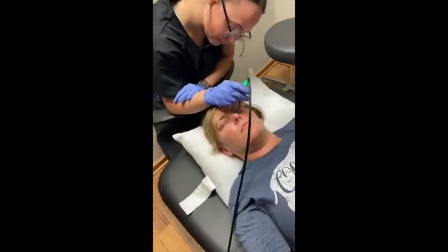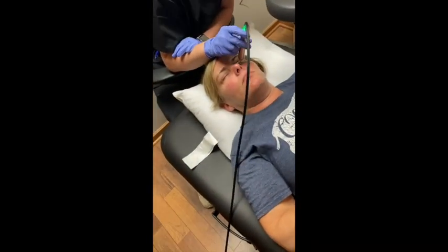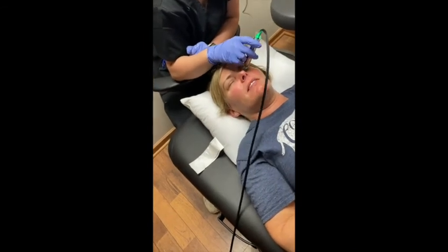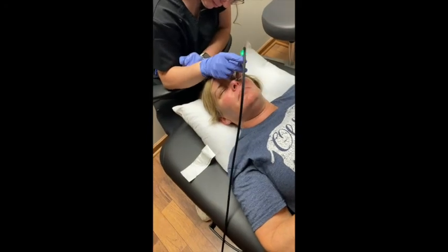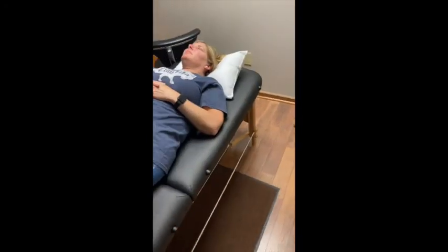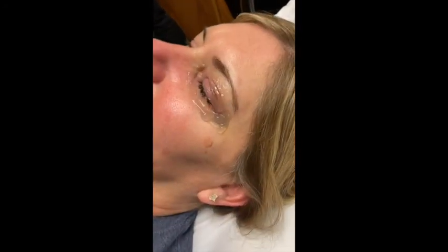And then at the end of the 10 minutes, we'll check and see kind of where the color difference looks like on all of it. And you'll be able to see quite a bit of color difference between that clear gel that we were originally starting with and the cloudiness and color there at the edge of her eye.